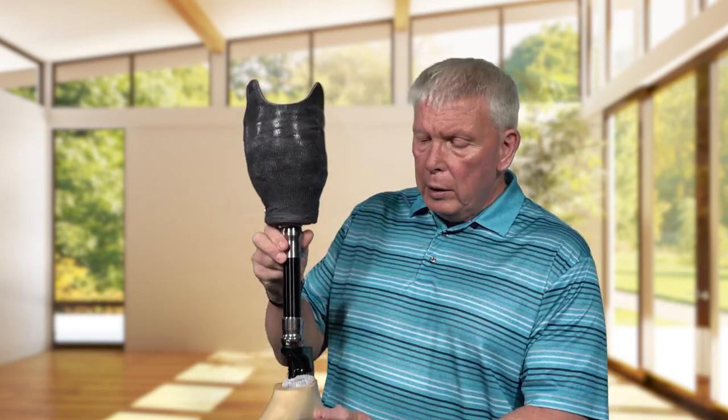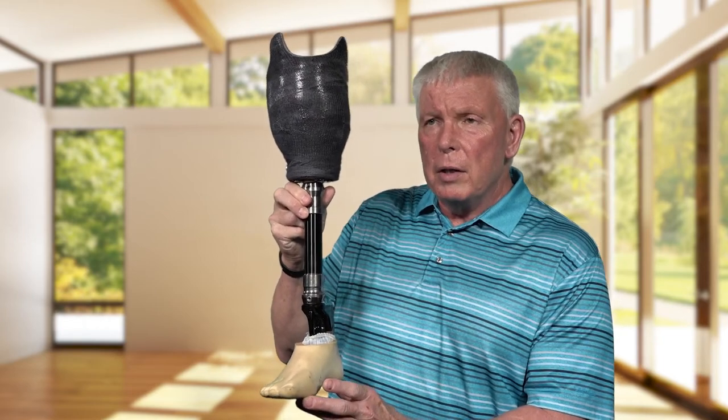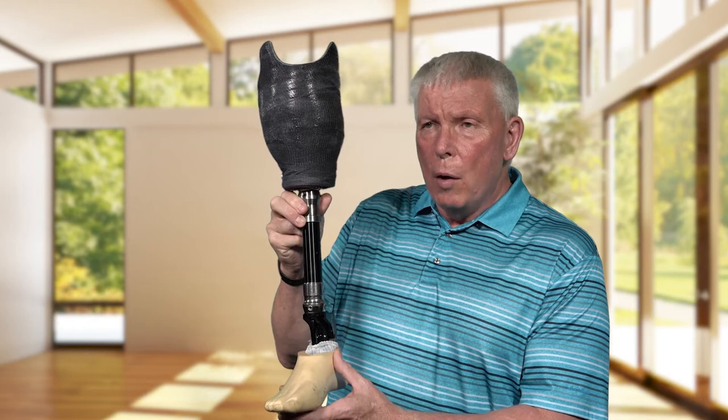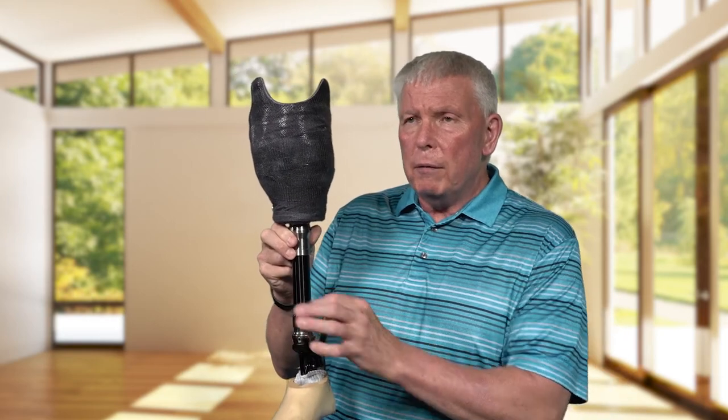They were kind enough, between me and them, we donated a very high-end foot that might cost about $5,000 in public. This is donated, and they donated the connector plates and the pylon. So when Dr. Bourgeois goes down, all we'll have to do is cut the pylon to length for the patient, and we will have a gentleman who otherwise could not work and support his family able to now go back to work with the help of this socket. We hope to do this more in the future and hopefully open it up to other campuses and faculty members.